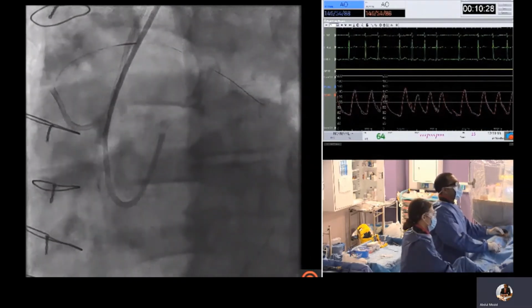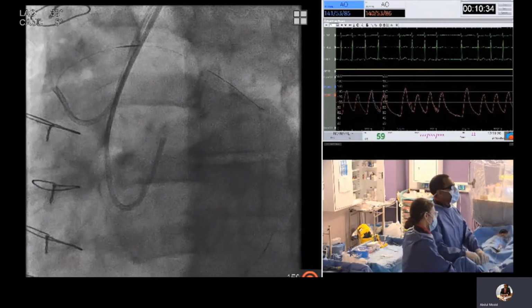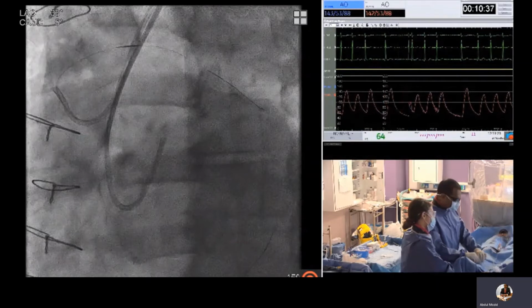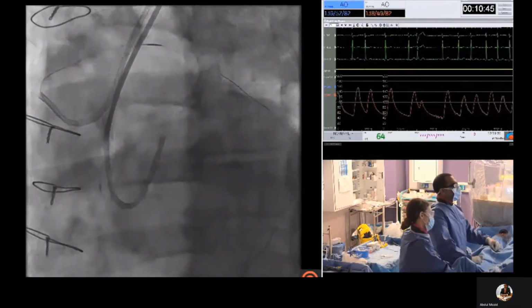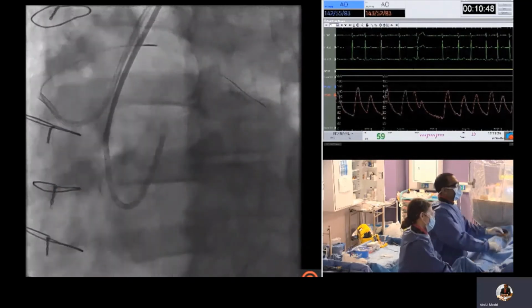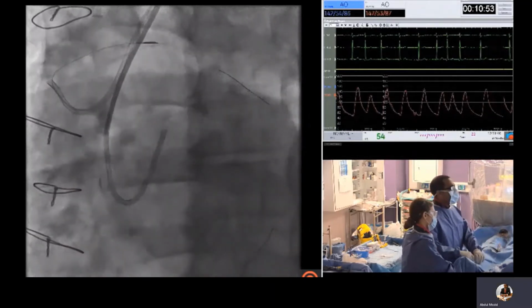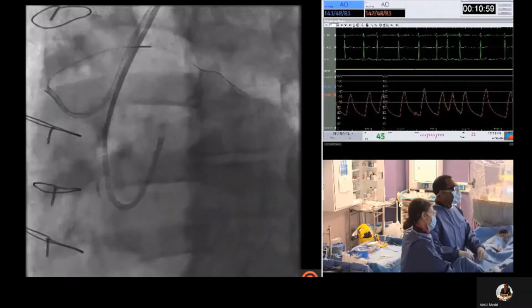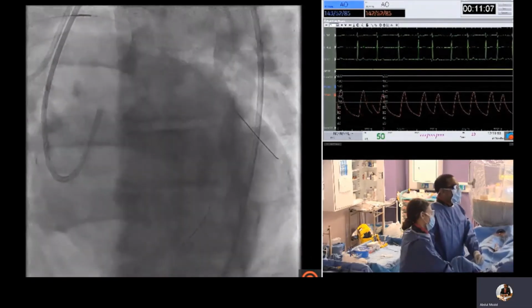So here Pilot 200 has made some progress to the distal portion of the graft, using the roadmap from the diagnostic procedure. I was confident that we were in the graft and nearing the anastomosis of the distal vessel. And again, with some wiring here, the Pilot 200 frees up and is now into the distal native obtuse marginal.